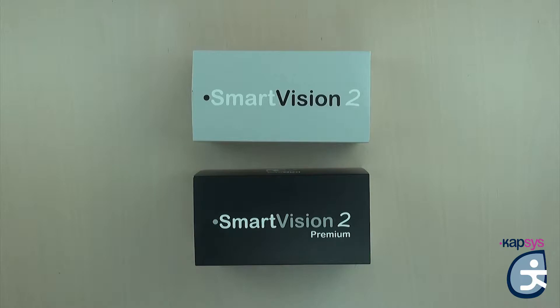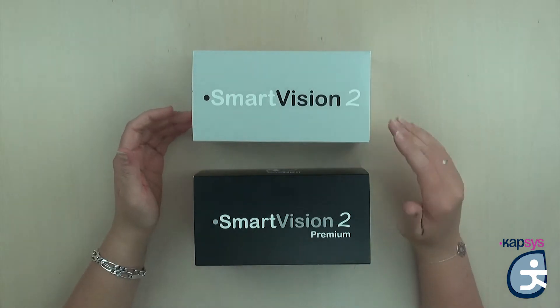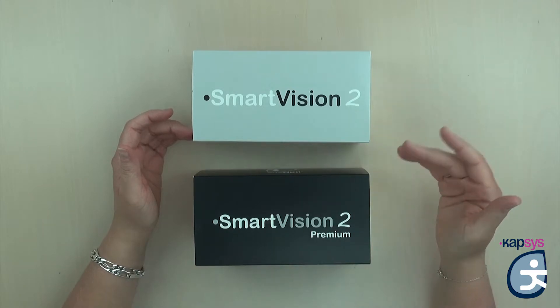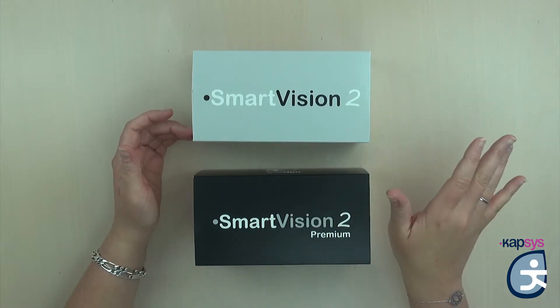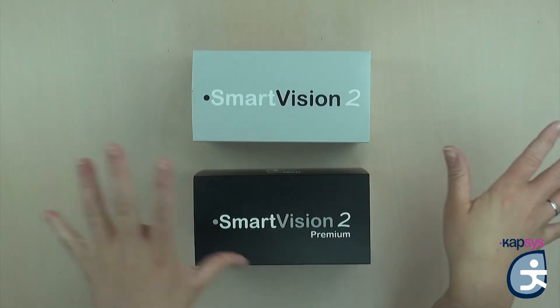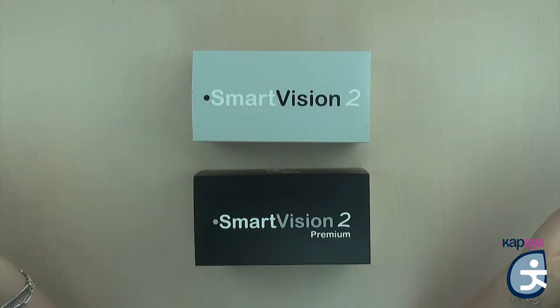The third exclusive application is the OCR. It allows you to take pictures of documents, perform optical character recognition, and vocalize the content. Those three applications will also be available on the Smart Vision 2 but for a limited free trial of 15 days. After 15 days, the applications are deactivated and you can purchase them either together or individually at your preferred retailer.